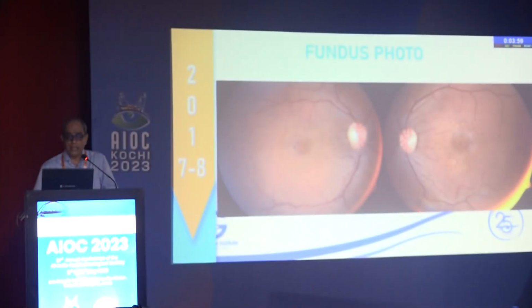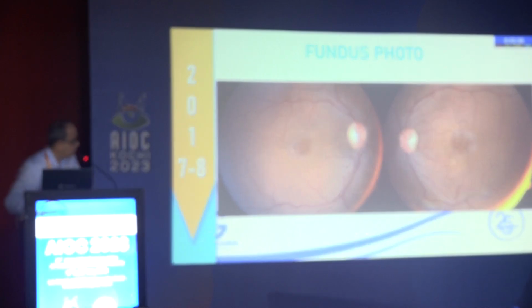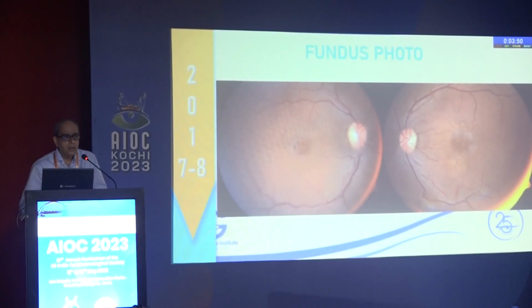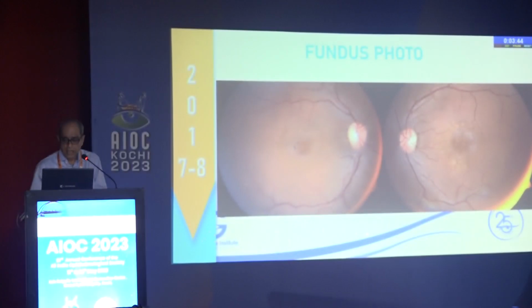Okay, macular telangiectasia. Now, this is the last thing. Now, what do you see here in this picture? Pigmentation in the red. So, parafoveal pigmentation, very diagnostic of MacTel. And then what do you see in the left picture? You see one dilated vessel. You see the right angle vessel there?